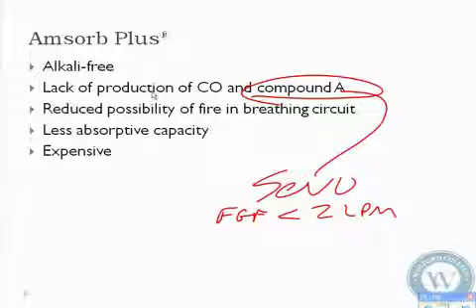Okay? Only at low flows. If your flows are greater than 2 liters per minute, then there's really no chance of it happening. All right? But Amsorb completely prevents that from ever potentially happening. So it doesn't happen. Okay? And carbon monoxide is formed at such a minimal amount that it's not even relevant either.